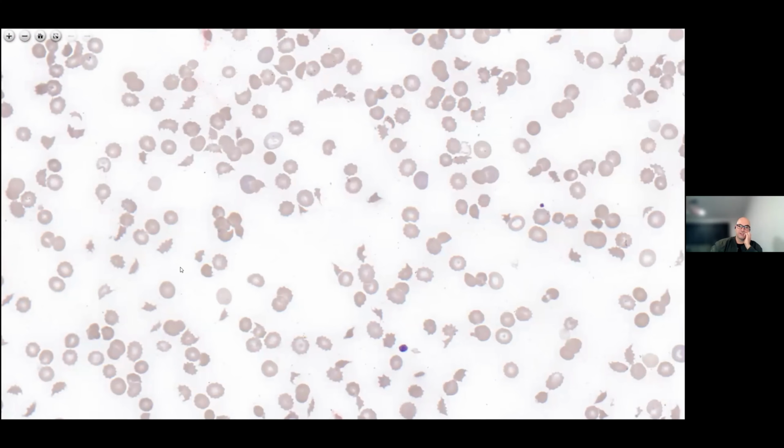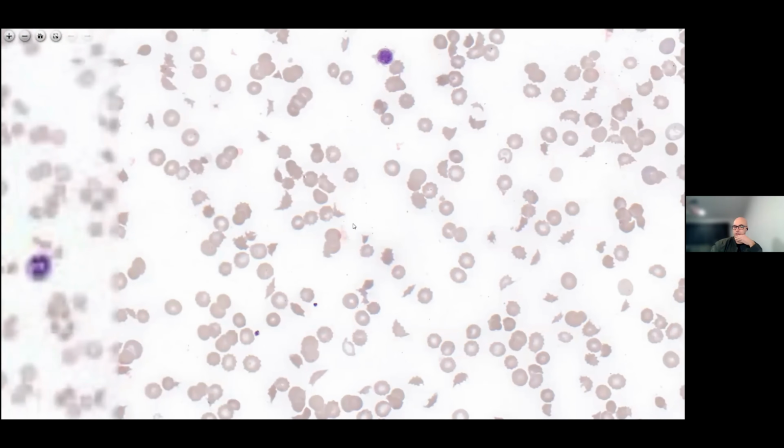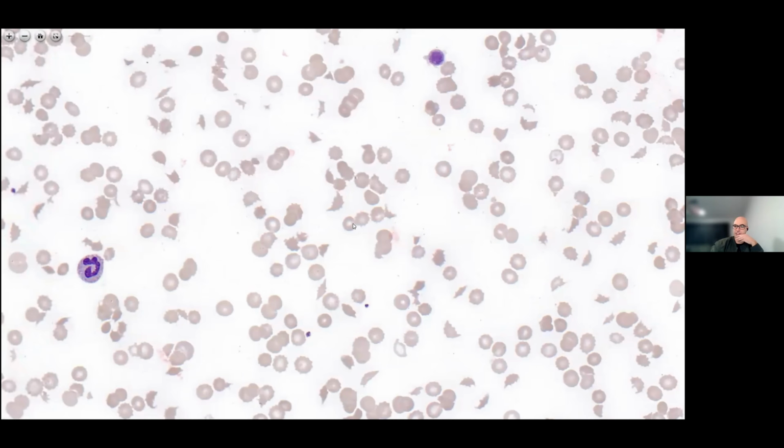In terms of a percentage, is there a significant number of schistocytes that should prompt concern? In my laboratory, our standard operating procedures for reporting blood films, we don't grade red cell morphologies. We only comment when significant morphologies have been identified. But I am familiar with the grading system that hopefully most laboratories are using, the ICSH.